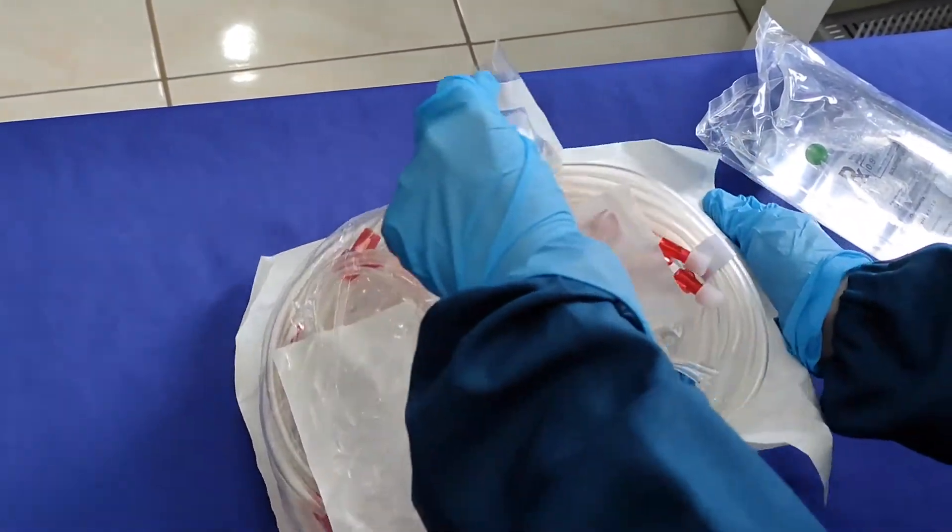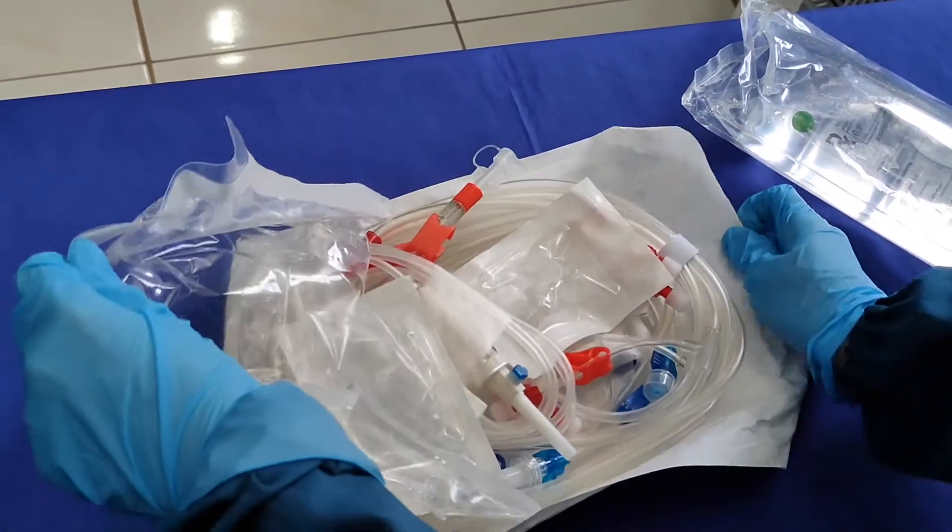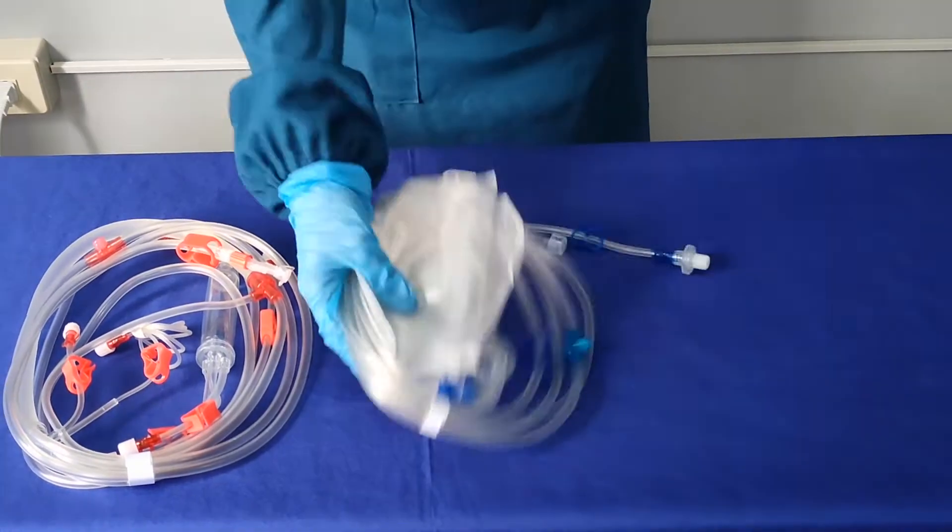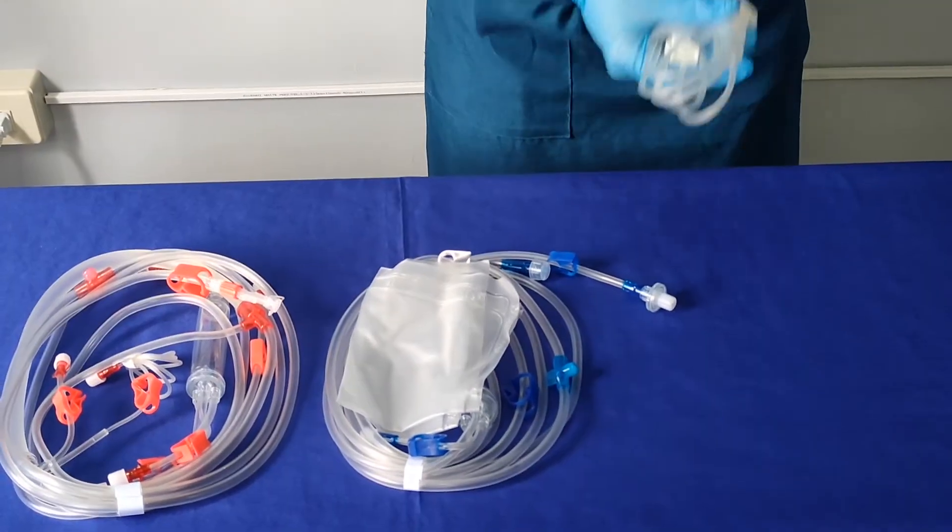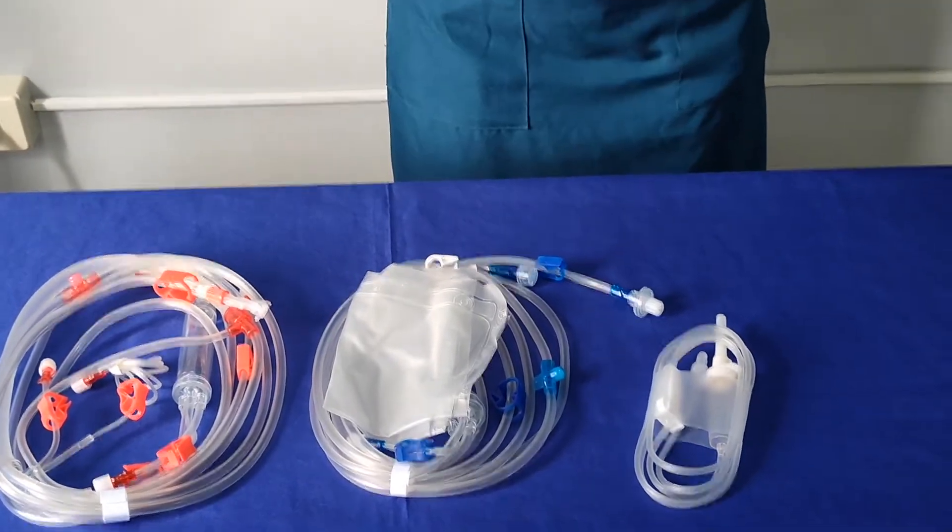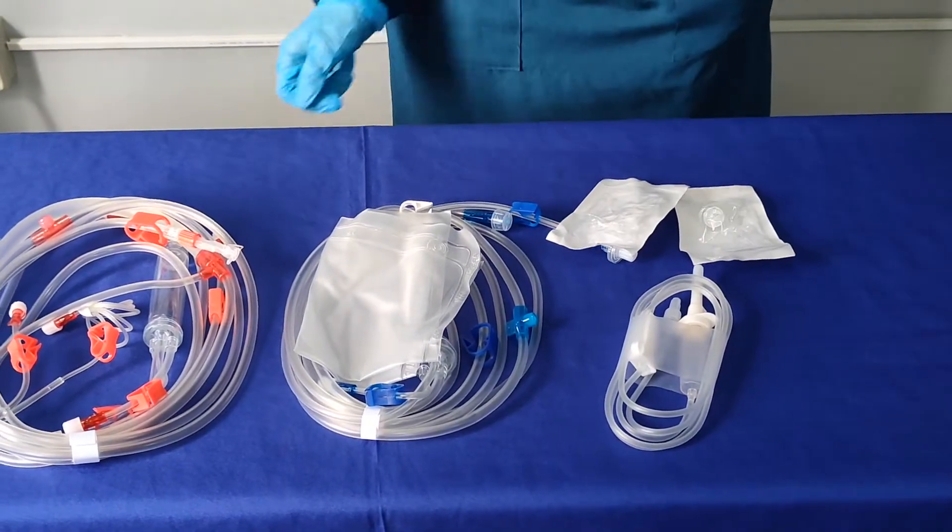The hemodialysis tubing set contains the arterial bloodlines, the venous bloodlines with drainage bag, the IV set for the NSS, and the transducer and connector.